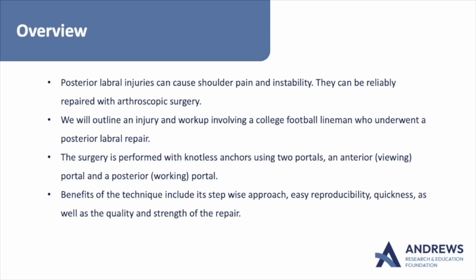Posterior labral injuries can cause shoulder pain and instability. They can be reliably repaired with arthroscopic surgery. We will outline an injury and workup involving a college football lineman who underwent a posterior labral repair.